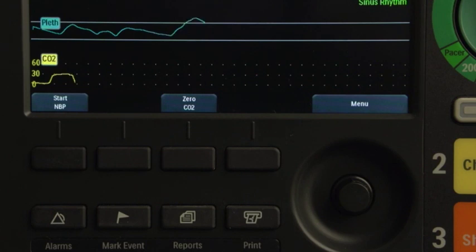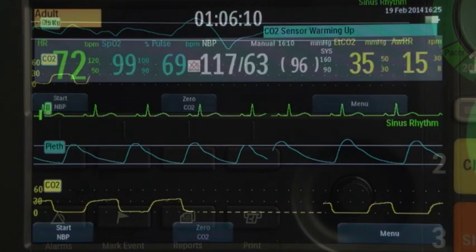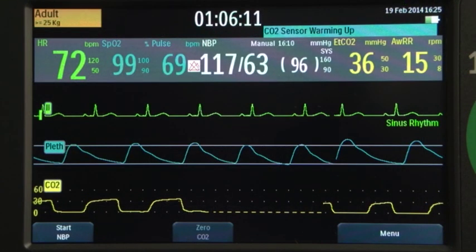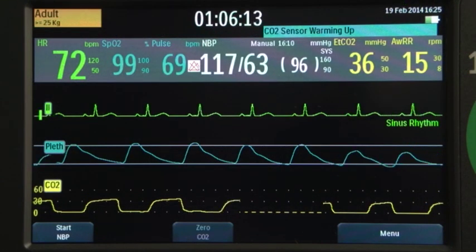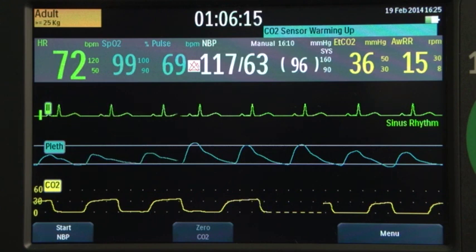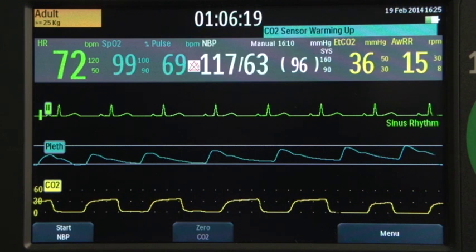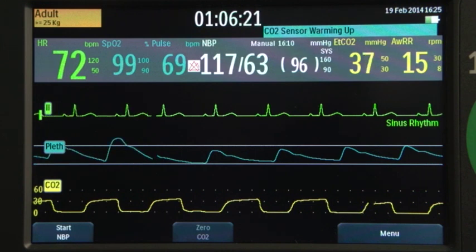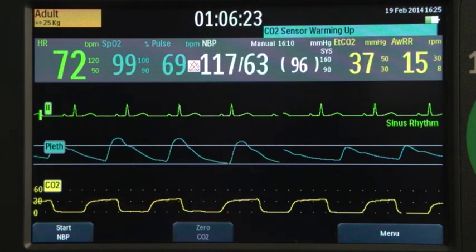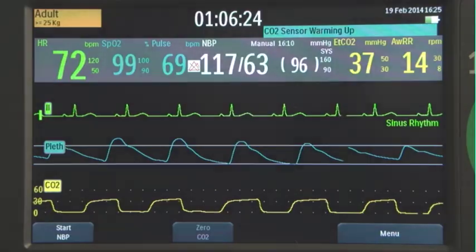With monitoring setup complete, we can now turn our attention to the therapeutic use of the device. The Officia DFM100 provides therapy options including semi-automatic external and manual defibrillation, synchronized cardioversion, and pacing.